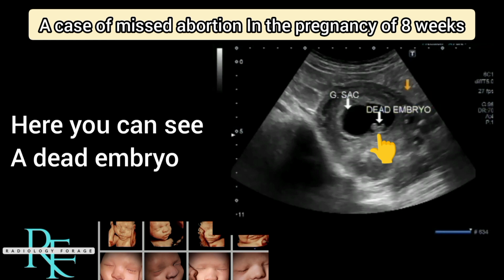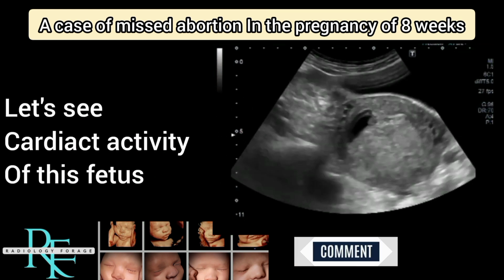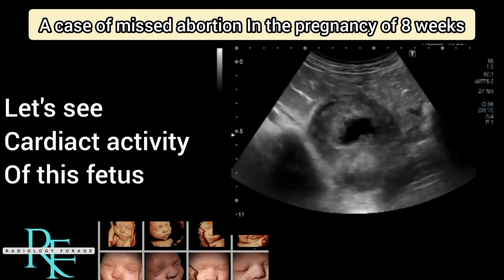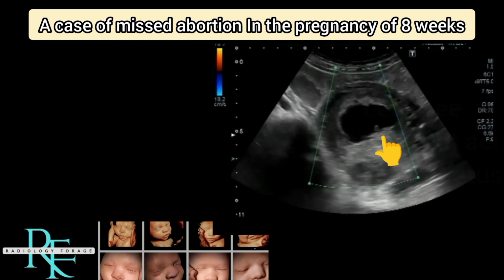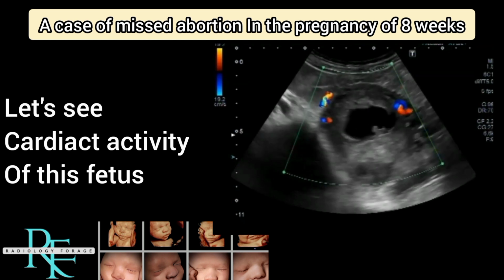Here you can see a dead embryo. This is a dead embryo. This is uterus and gestational sac. Okay, let's see cardiac activity of this fetus. Now you can see a tiny embryo. Let's see cardiac activity of this fetus.